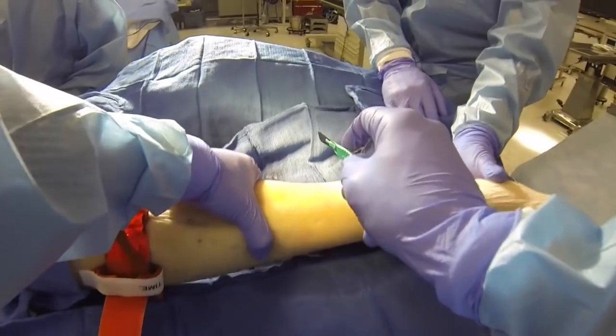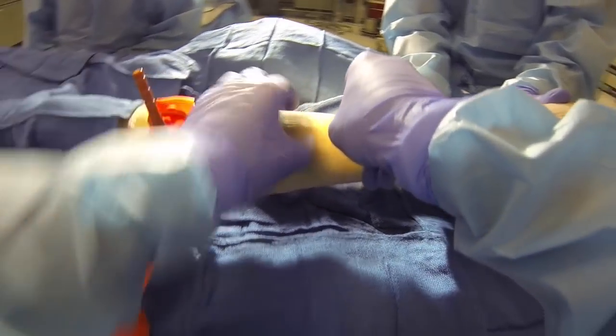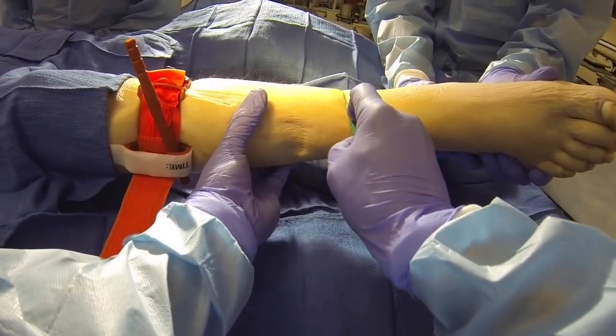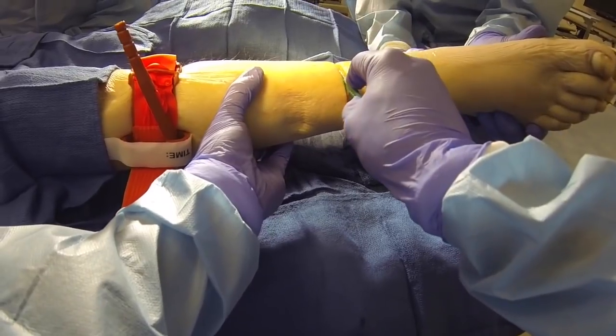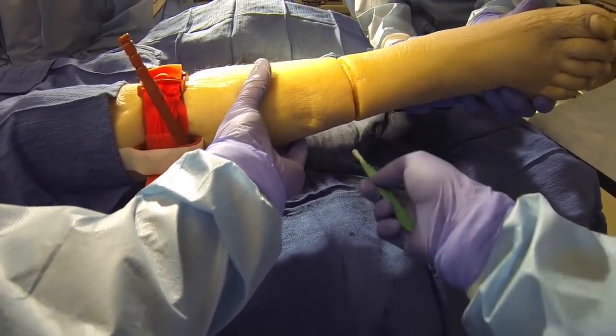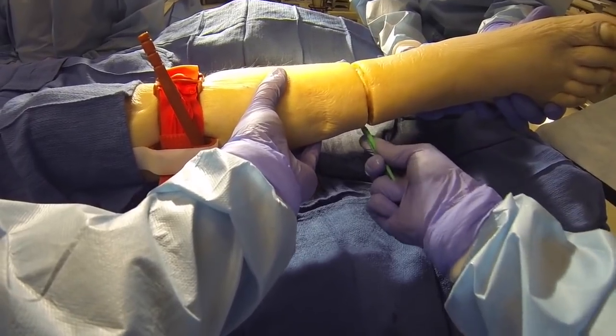Next, utilizing your 10 blade scalpel, make a circumferential skin incision at the lowest point on the entrapped limb at the site you have selected. Ensure that you incise through all of the soft tissue completely down to the bone, severing any tendons that are accessible at this time.